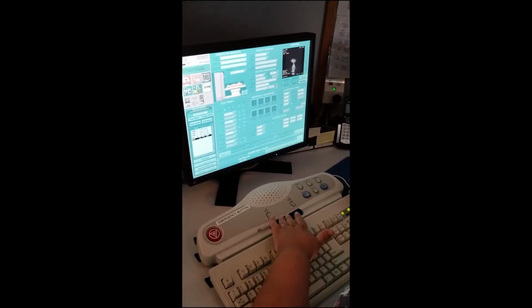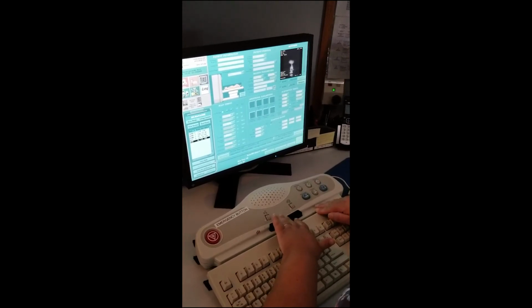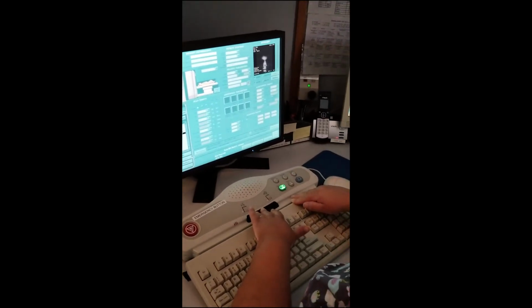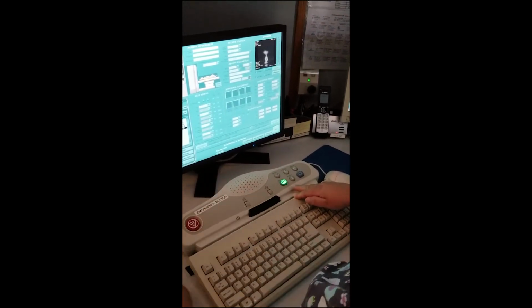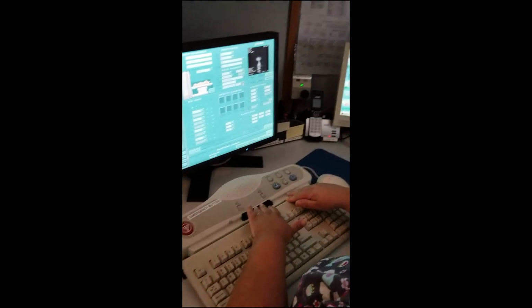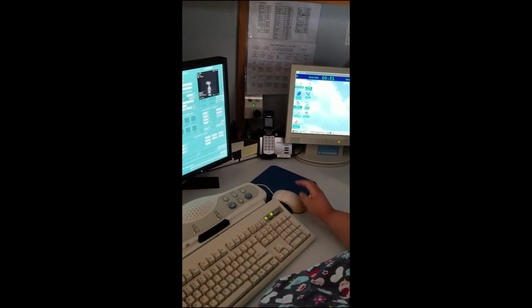Hi, Eric. How are you doing? Tell him it's the last one always. All right, this is the last one. The table's going to move, and here comes a noise. It's going to be about a minute. Okay, rock and roll.